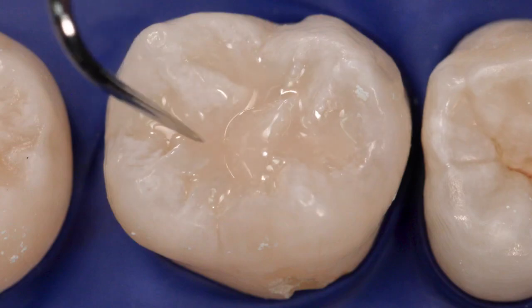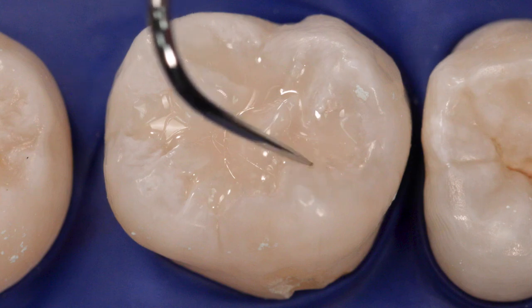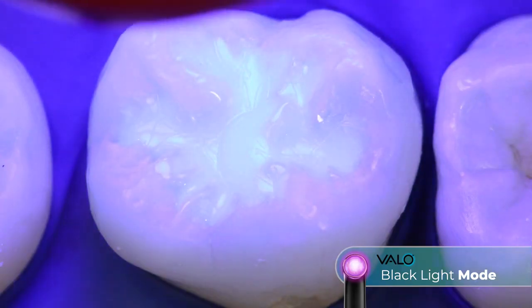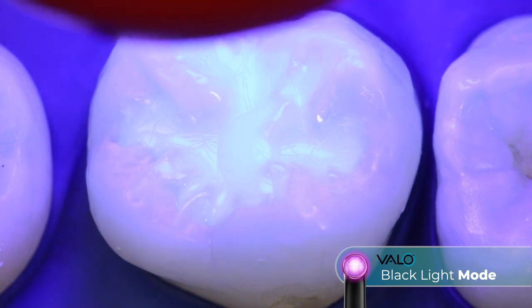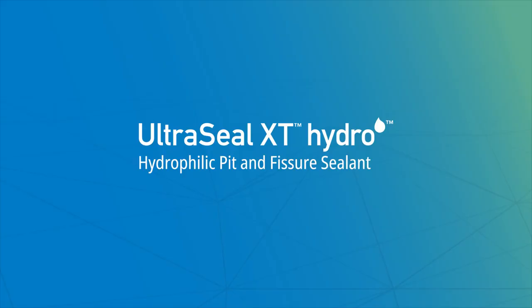Finally, use an explorer to ensure that pits and fissures are sealed. Adjust occlusion if necessary. After placement and on returning visits, use a black light to check for visual verification of marginal retention.